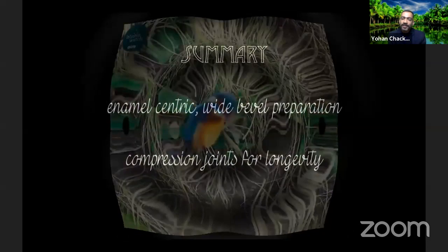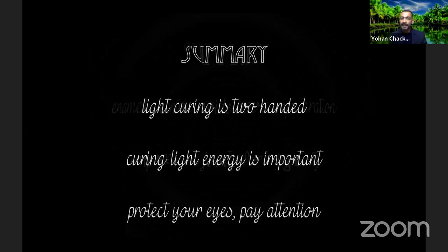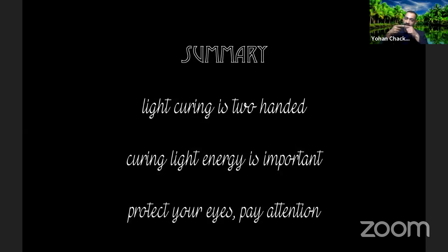So to summarize what I've said today, your preparation design has to change. Make it enamel centric with a wide enamel bevel preparation, and use compression joints and not tension joints for the longevity of your restoration. Light curing is a two-handed technique. Curing light energy is important. Protect your eyes and be a Kingfisher.